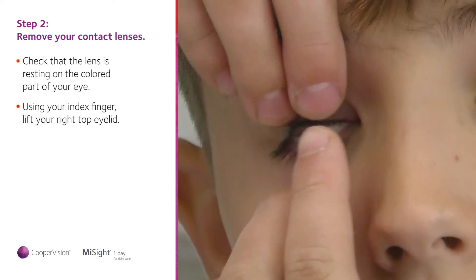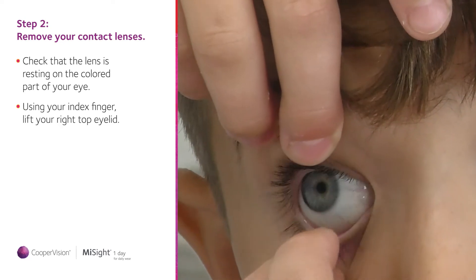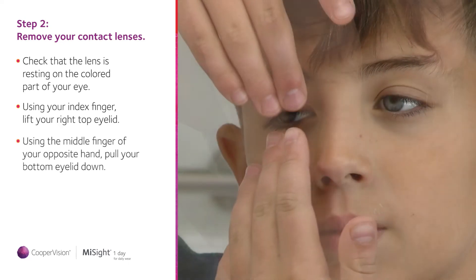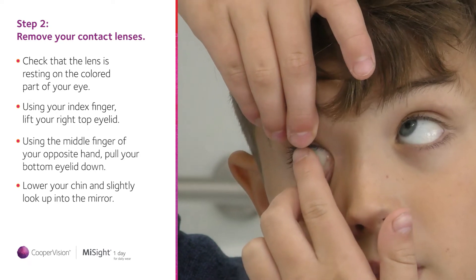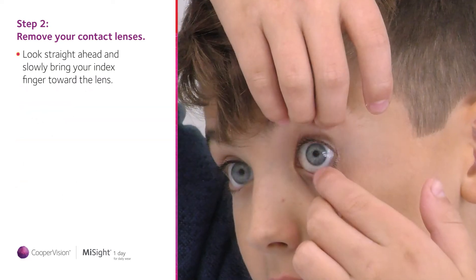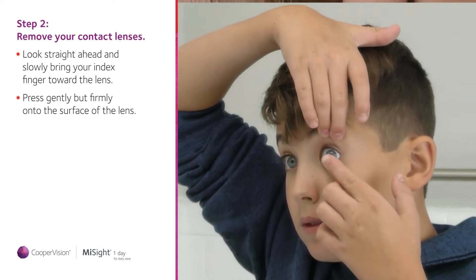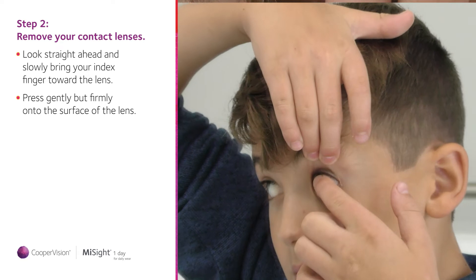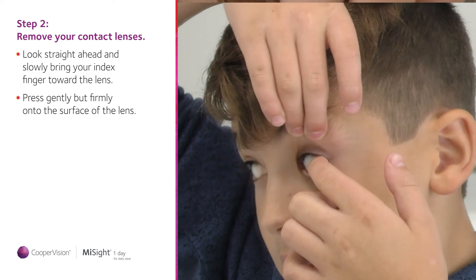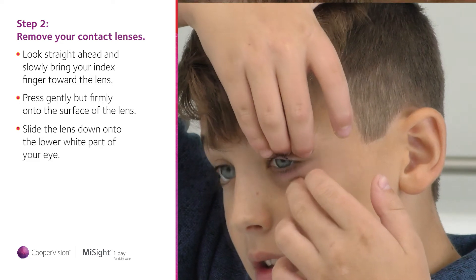Using your index finger, lift your right top eyelid out of the way by holding where your lashes meet your eyelid. Using the middle finger of your opposite hand, gently pull your bottom eyelid down. Now concentrate on keeping both eyes open and look straight ahead into the mirror. Slowly bring your index finger toward the lens. Press gently but firmly onto the surface of the lens and slide the lens down onto the lower white part of your eye.